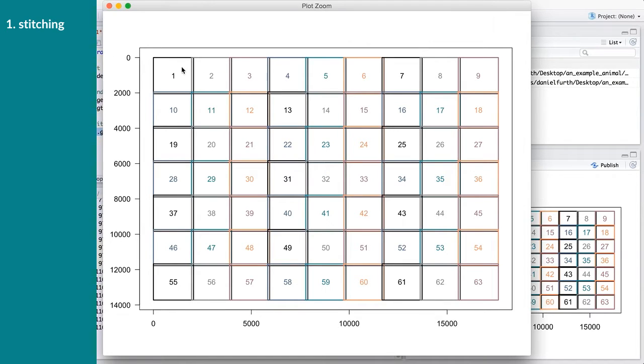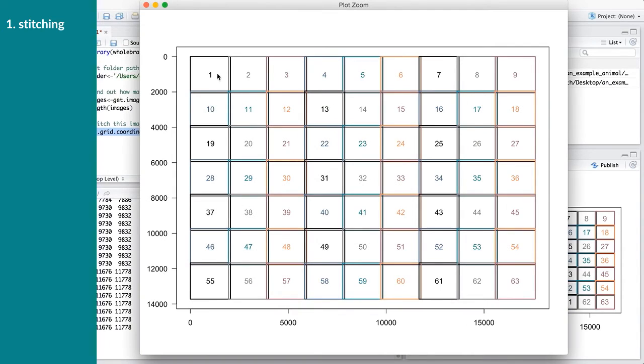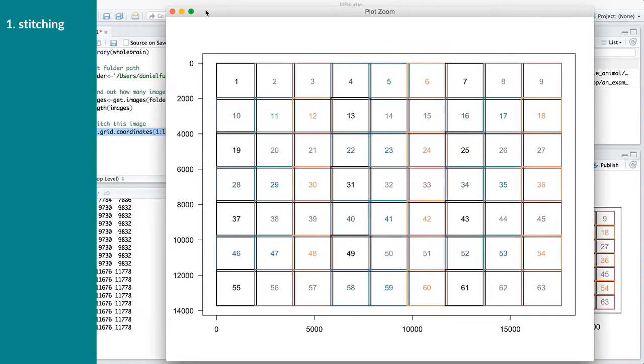There. Okay, so as you can see here, each number is a single tile, 1, 2, 3, 4, 5, and they are lined up and overlapping at the edges. So you can basically see this 0.1 overlap, which is 10%, and you can also see that we roughly have an image that will be 13,000 times 16,000 pixels. So that's basically how the stitch algorithm is going to stitch all of these tiles together.